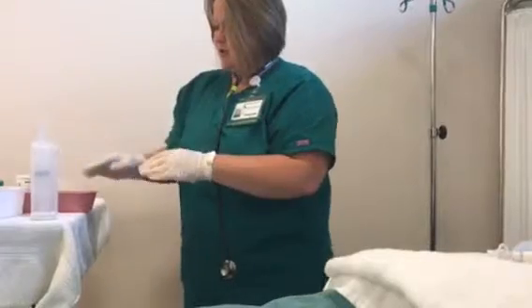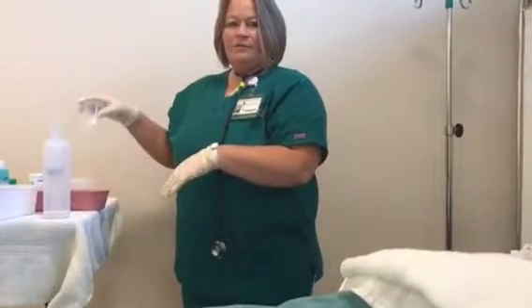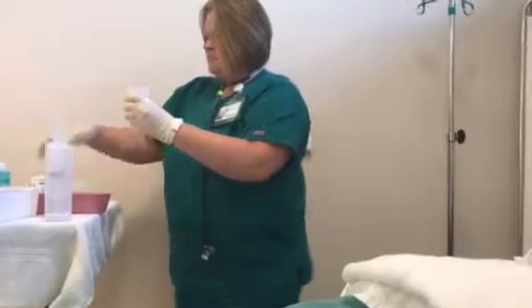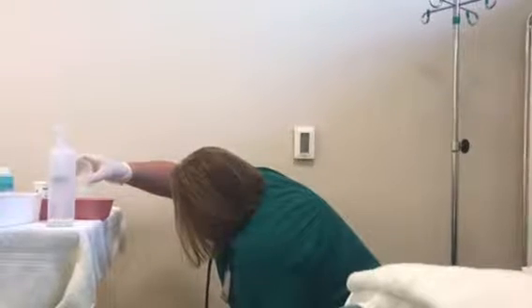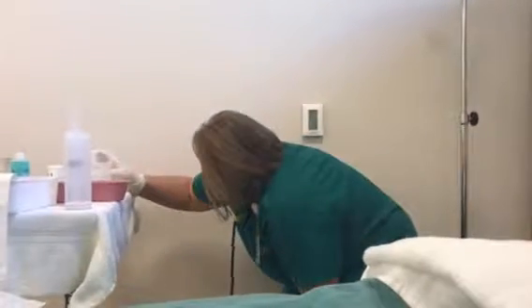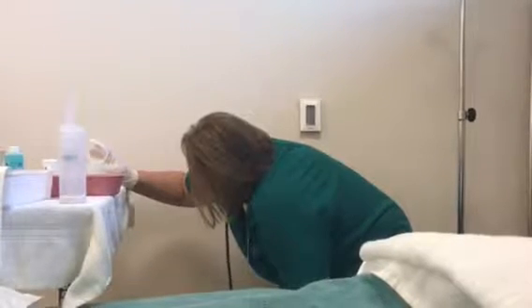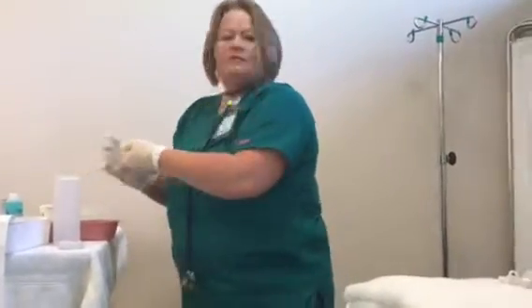Before I do that, I need to measure out. The doctor's orders that I looked at indicated that I need 2 10 ml flushes and 20 ml of nutrition. So let's go ahead and do that. I've already shook my formula. So we got 10 mLs of flush, another 10 mLs of flush, and then we're going to give 20 mLs of nutrition. Good. Okay. So we can go ahead and get started with our enteral nutrition.